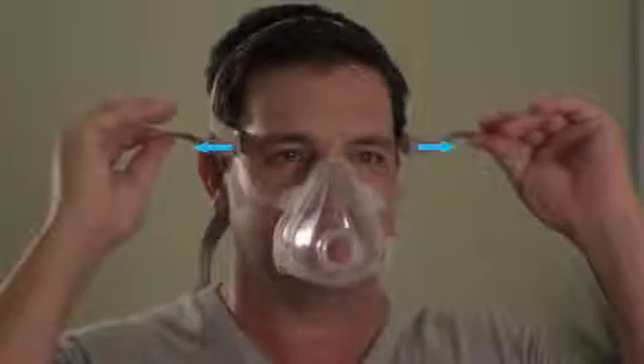Undo the upper headgear's fastening tabs and adjust both straps evenly. The top straps only require minimal tension to achieve a good fit, so tighten them only enough to position them securely. Then refasten both tabs.